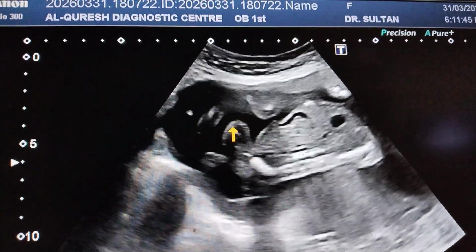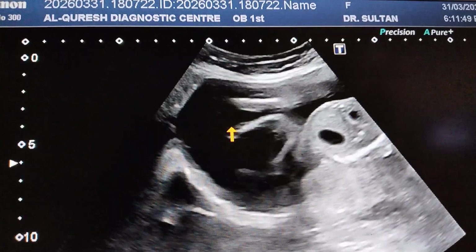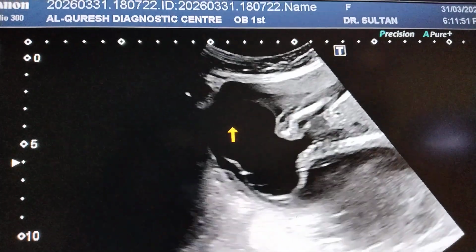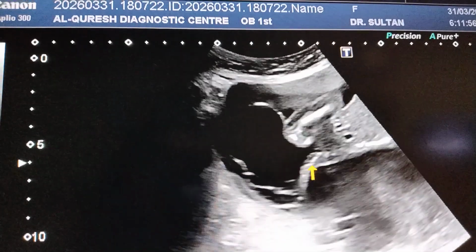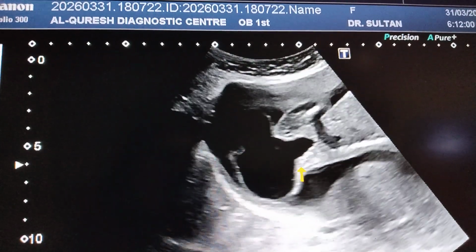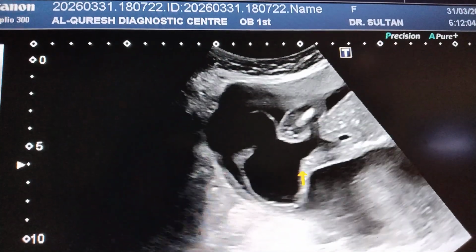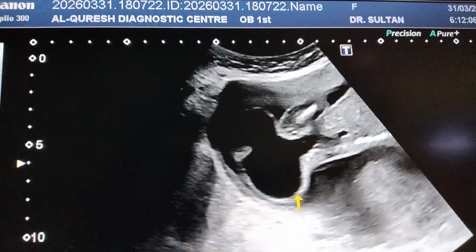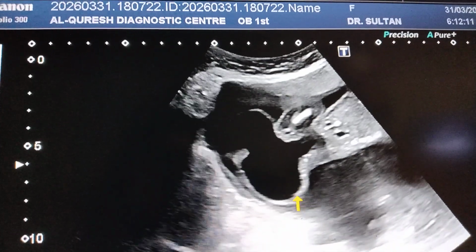So this is the spine, and this is the lesion. Look here, this is the spine, this is the lower lumbar region, and this is the sacrum, and this is the coccyx, this one.